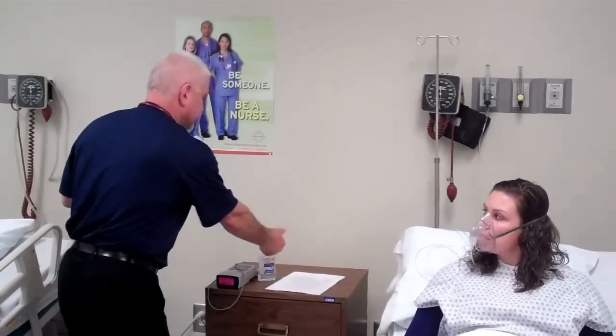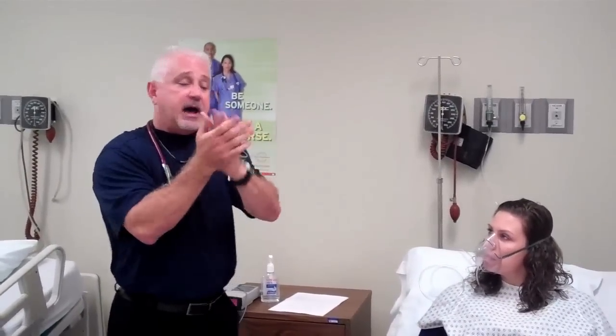I'd ask if she has any questions. At that point, having reassessed heart rate, respiratory rate, SpO2, color, and level of dyspnea to confirm I can leave, I would wash my hands, take my documentation sheet, and proceed out of the room. I'd place a no-smoking sign and an oxygen-use sign on the room, and then chart the patient's therapy.